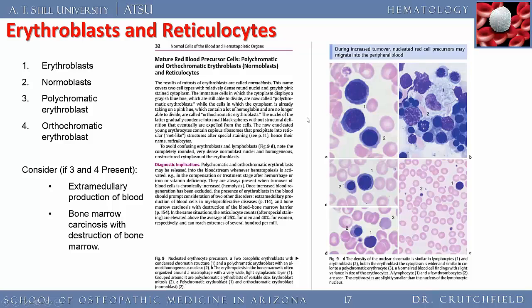So now let's look at these red cells and how they're formed. So we've already spoken about reticulocytes, how they're precursors to the initial erythrocyte, but the reticulocytes themselves come from the erythroblast. And over here we're looking at what these various cells will look like. So here is an erythroblast, and eventually out here in the peripheral circulation, we can see that mostly this patient's got normal looking red cells.